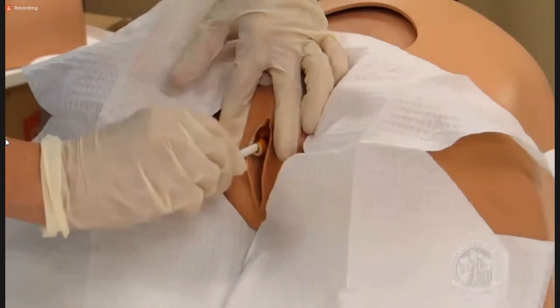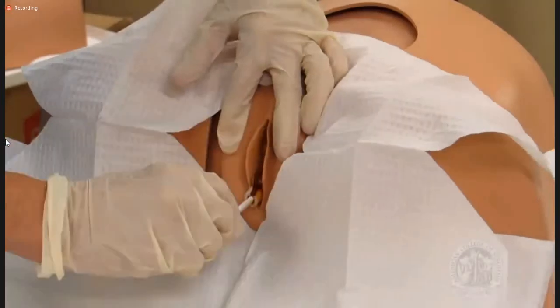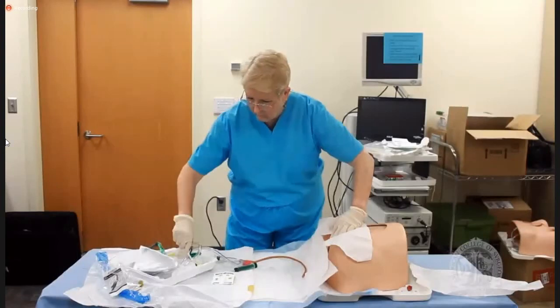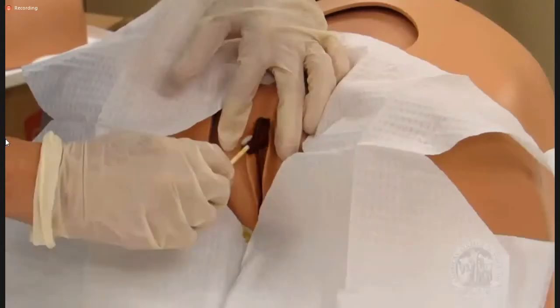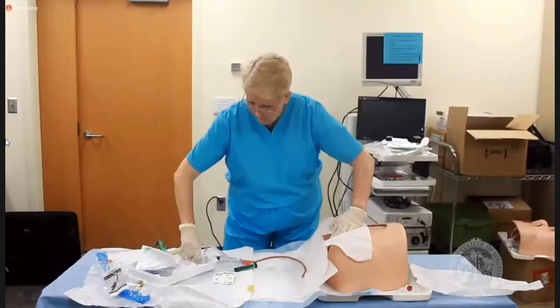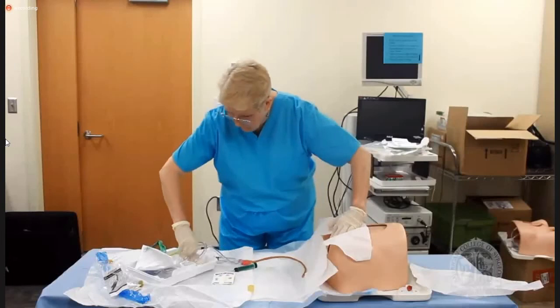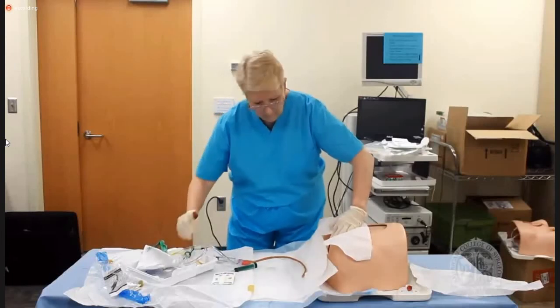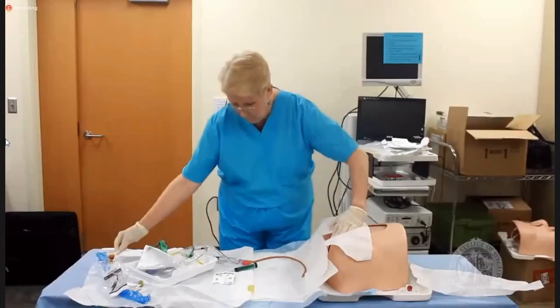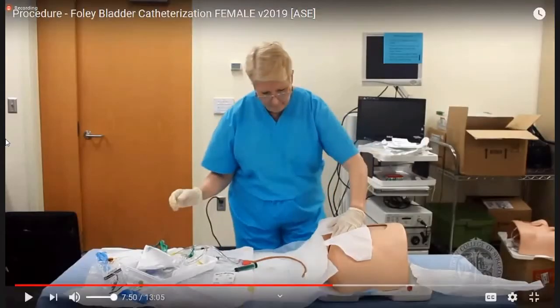Spread the labia majora and minora apart with your non-dominant hand, exposing their urethral opening. Your non-dominant hand is now contaminated and cannot assist in placement until the catheter is in place and the balloon is inflated. Cleanse the periurethral mucosa from the top down toward the vagina using one downward sweep of the prep solution, then discard. Use the next two prep sticks swab for one sweep.